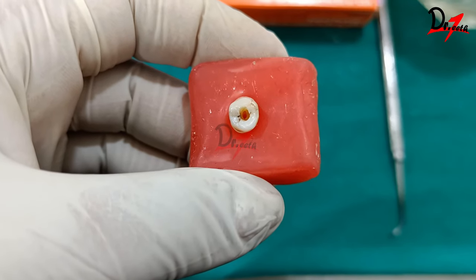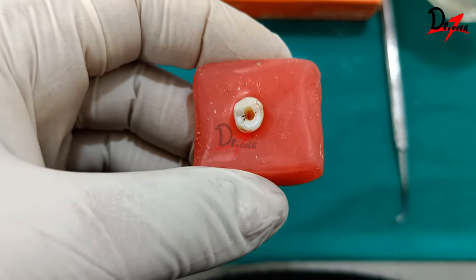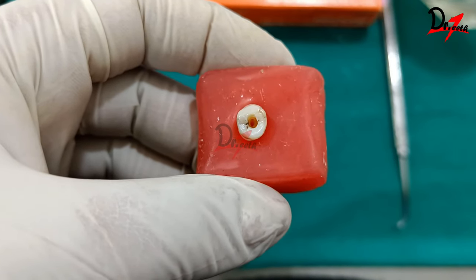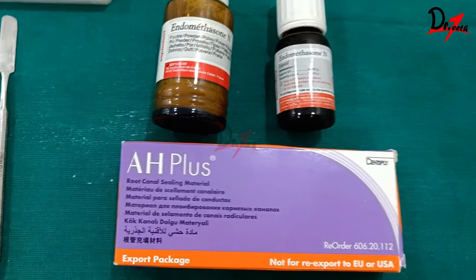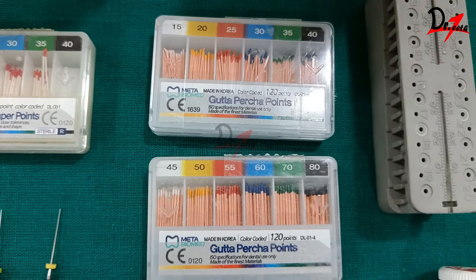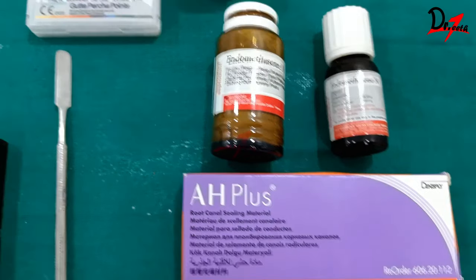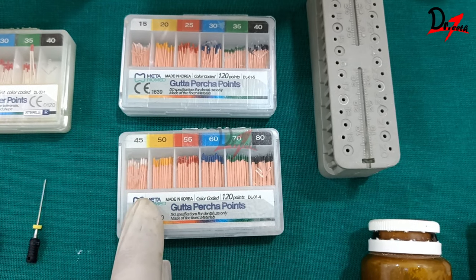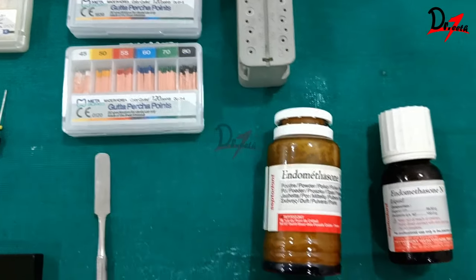We need to obturate completely to our working length — from the coronal reference point to the minor diameter. For obturation we require a sealer and gutta-percha cones. I have GP cones from #15 to #40 and #45 to #80. Since gutta-percha does not adhere to the canal wall, it needs a medium. We also require three-dimensional obturation to prevent percolation, so we coat the canal with sealer.